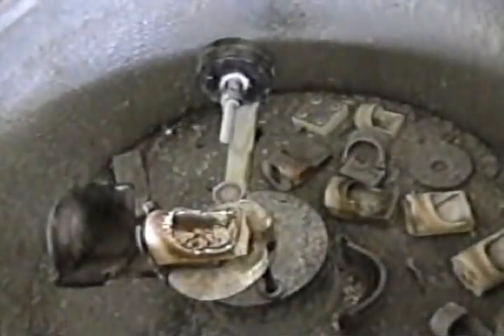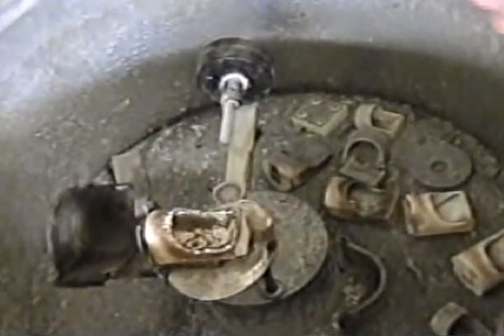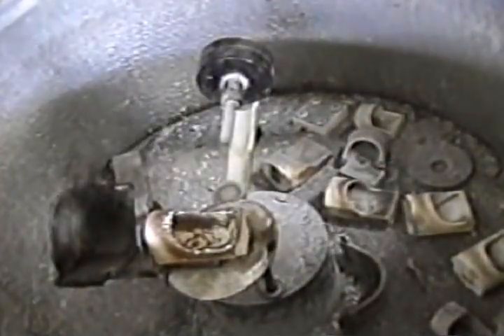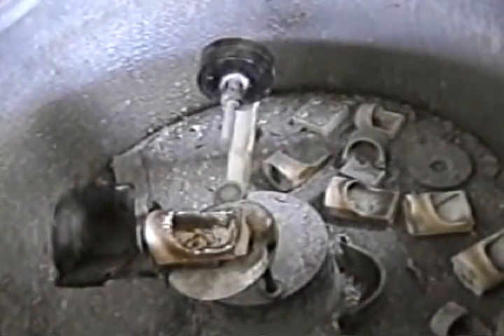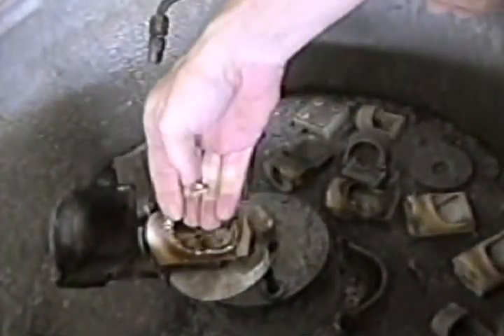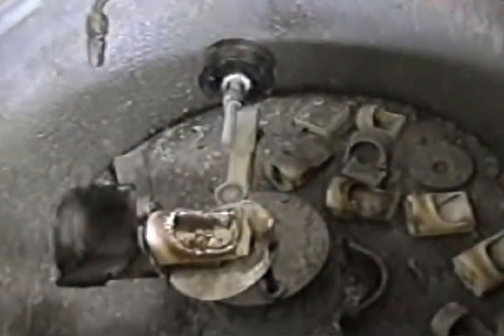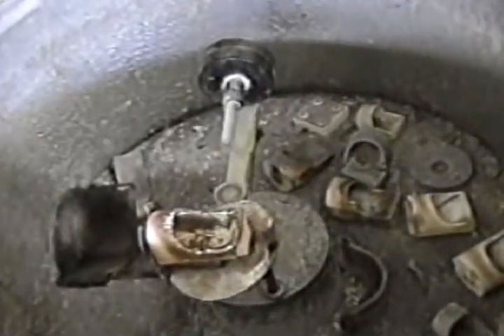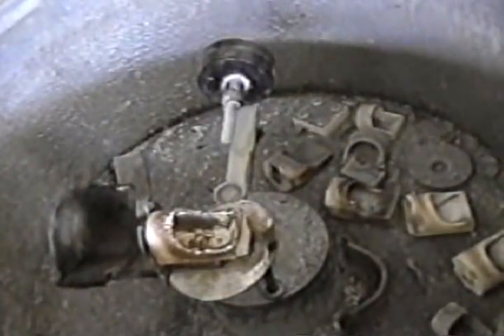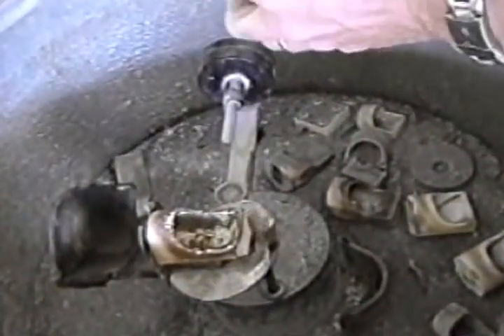So I'm going to go ahead and get my Harris torch here. Get my gold. Using a lot of gold for this casting because it was such a big crown and I had all the reservoirs. I'm using oxygen and propane.